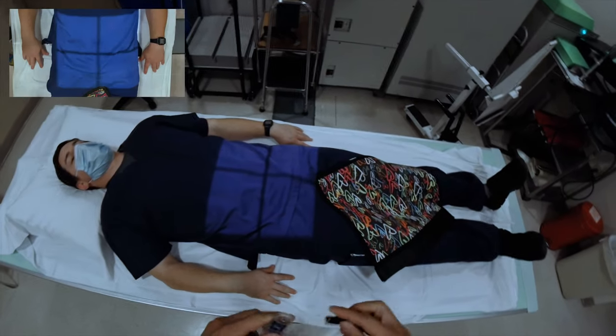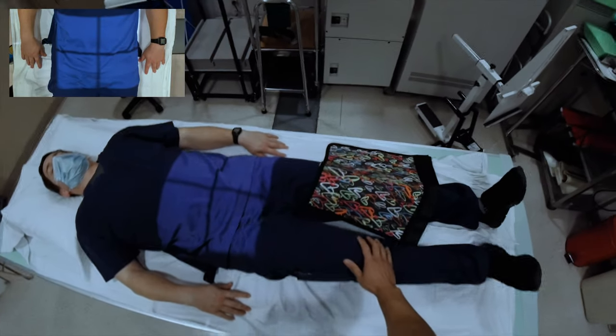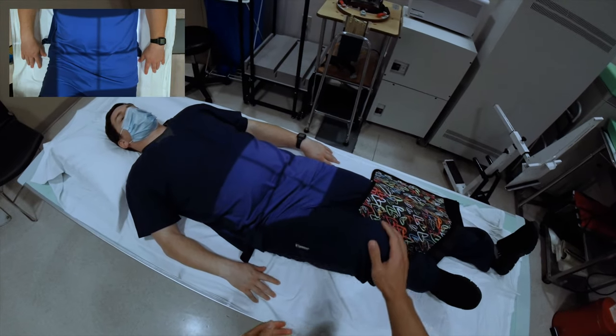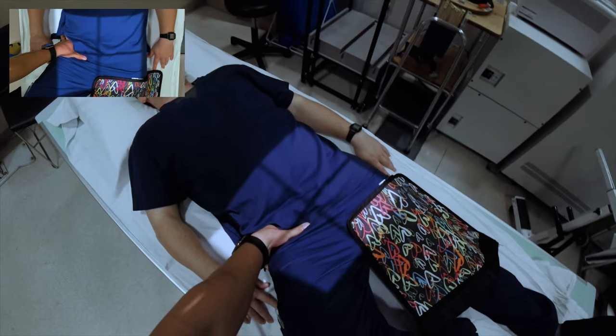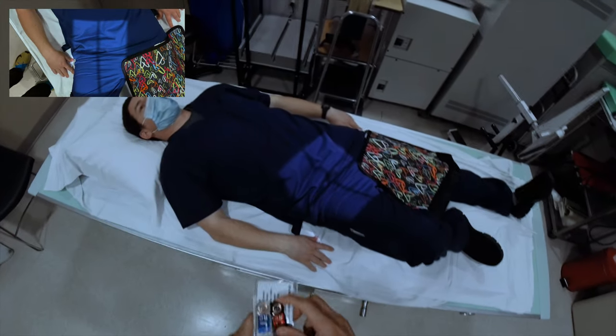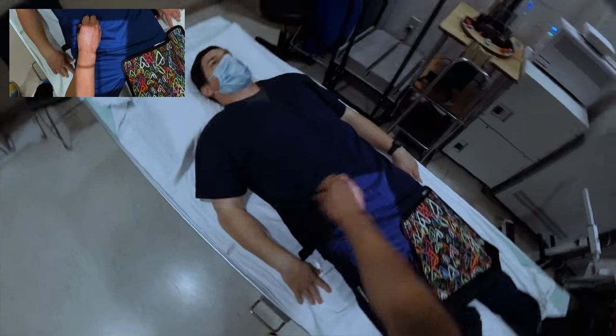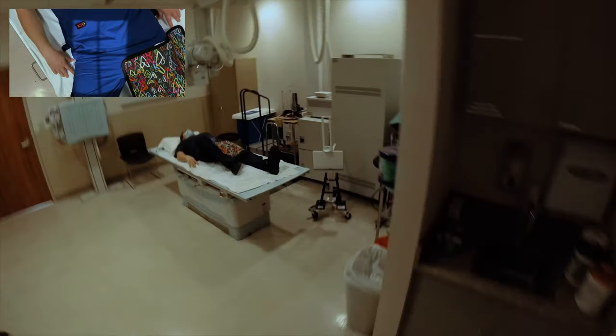All right, and then it's your right hip again, correct? Yes. Okay, so you're going to bring your right knee up about halfway, right about there. You're going to drop your knee down towards me halfway. Right there is good. And then I'm just going to feel your hip here again, all right? Hold still. All right, you can relax, we're all done.